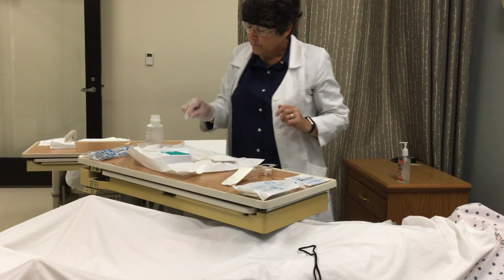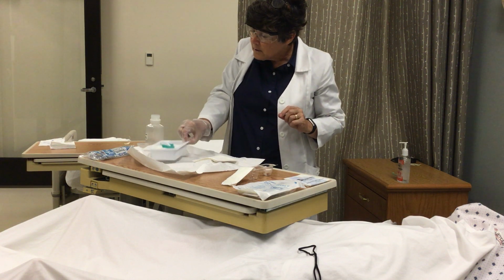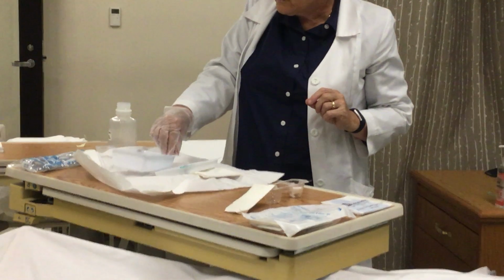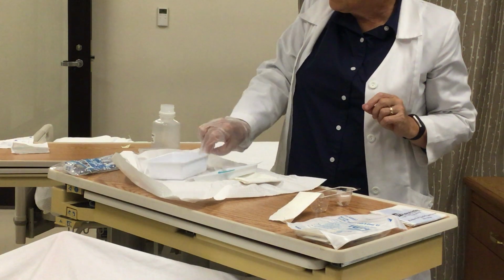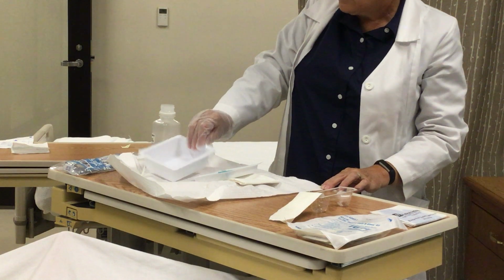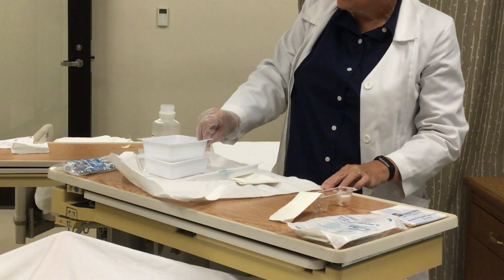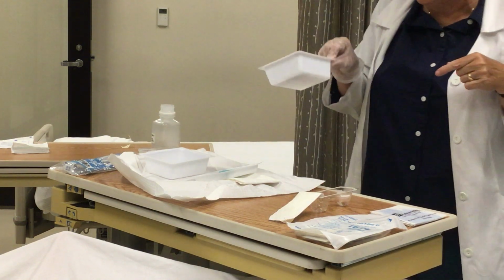This particular kit has a sequence of little basins. They're kind of like little Russian nesting dolls. And you just have to parcel them out. There are two larger ones. You may need all of them, you may not, it depends on your institution, the policy, how they go about all this. If you can't get them apart, you can just stick your hand in here and pick it up and move it over. Now this does not have to be sterile on the outside, just the inside where I'm pouring the solution.